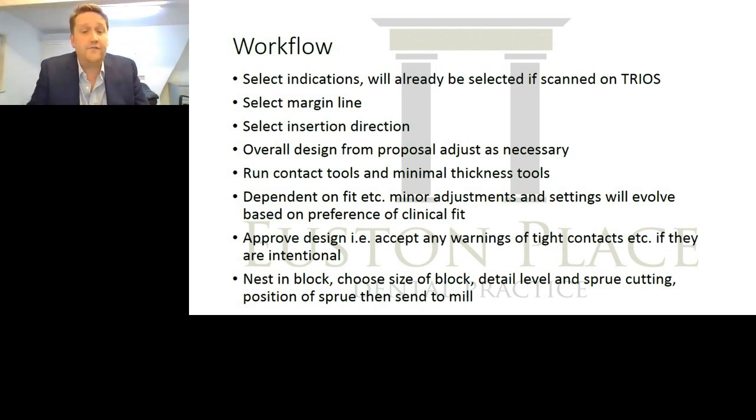Then the final bit is nesting it in the block. You want to choose the correct size of block and the detail level. So you've got standard definition, high definition, whether you want the sprue cut away, the position of the sprue in the block, and then send it to the mill. And there are a few things to consider on that last step as well.